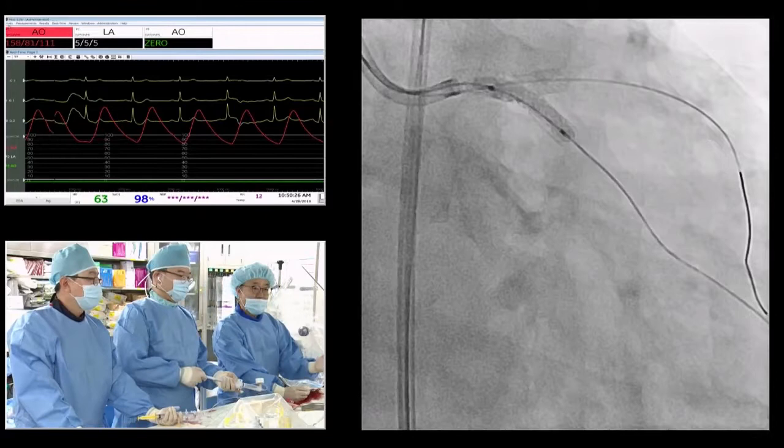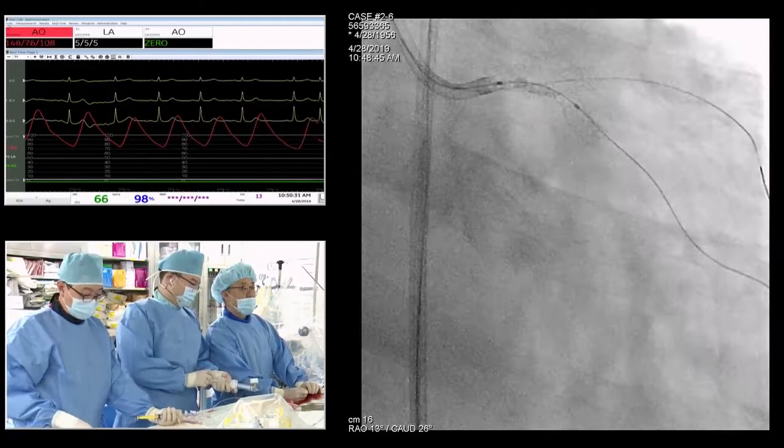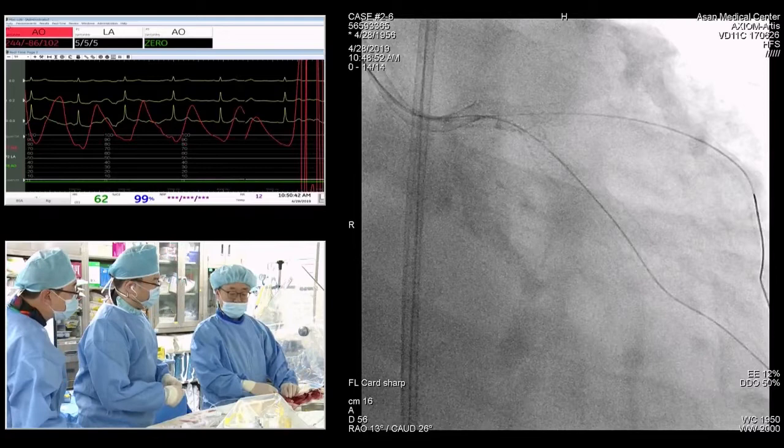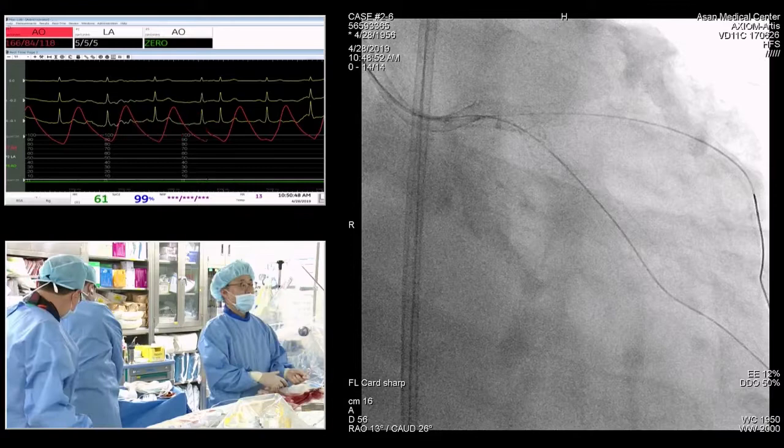It looks like there's a waist on that balloon. You may want to give it more time. What size balloon do you use? 2.5. Yeah, it's a small balloon. You may want to use a little bit bigger balloon, and hyperinflation is up to 25 or so.